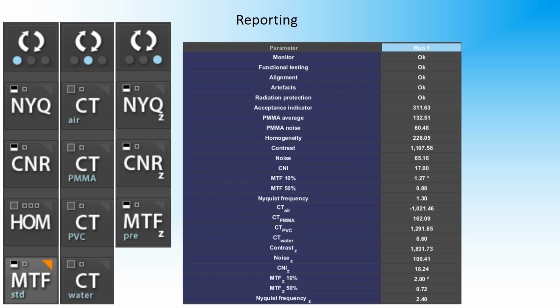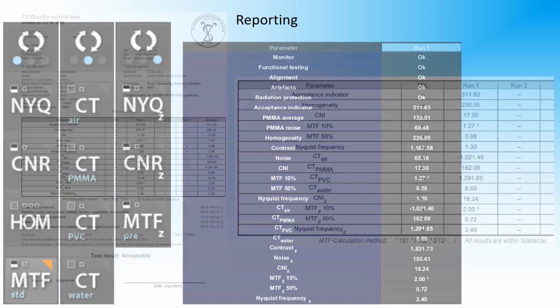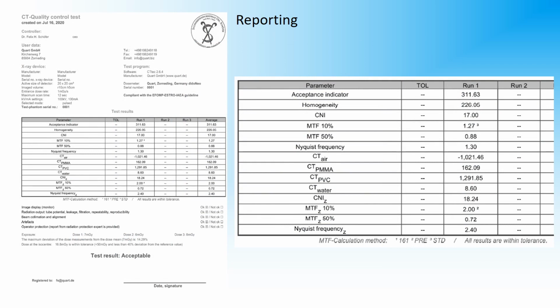Then we of course can see all these results in a table. We can export this data into Excel, and on the next page I will show you a full report. There's a pre-designed report included in the software that can be left with the device tested for reference. It includes all the used devices and who did the testing, and the main points of the tests.